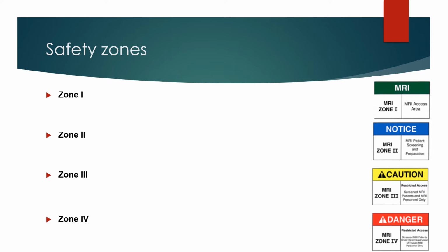Zone 2 is still a public area, but it is the interface between the unregulated Zone 1 and the strictly controlled areas of Zones 3 and 4. MRI safety screening occurs here under supervision.